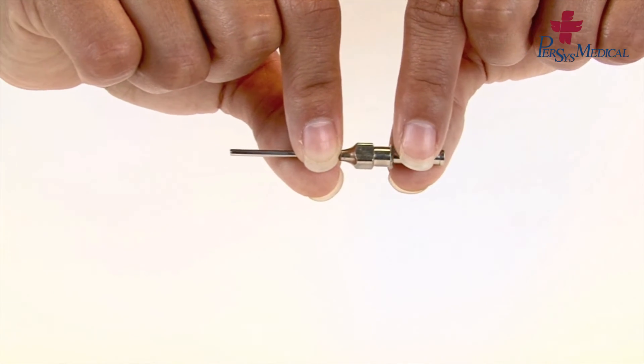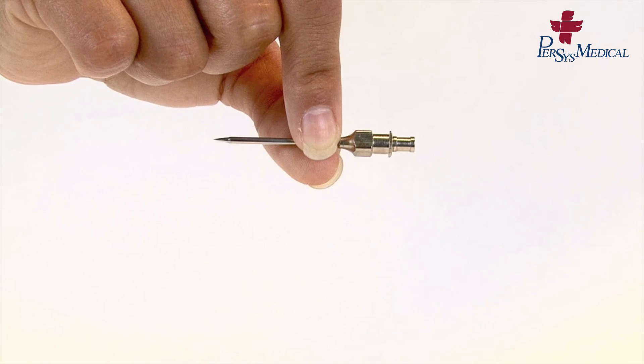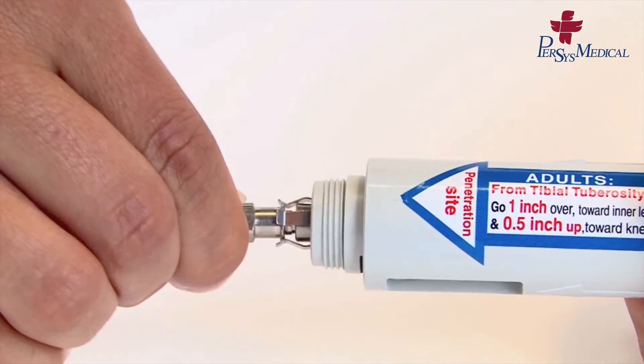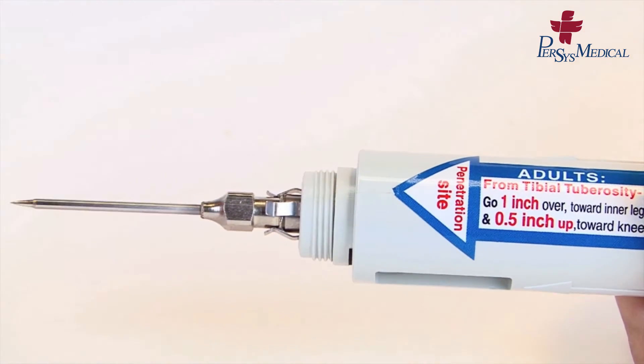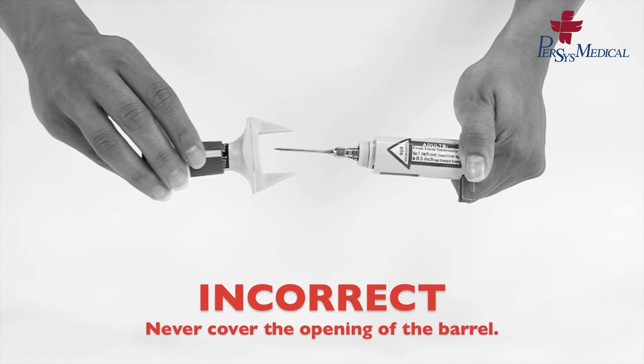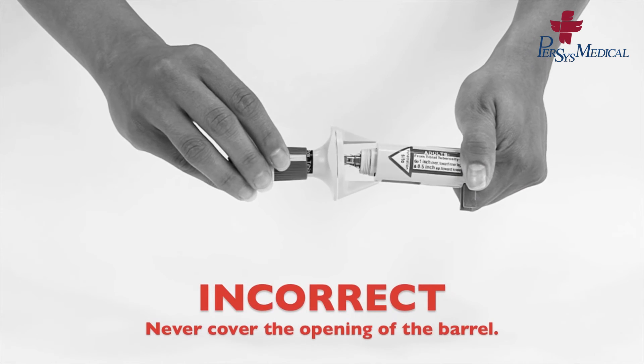Carefully place the needle into the cannula. Keeping the spring and piston pointed away from you, attach the needle and cannula to the clasp and ensure that it is secured. Always keep the spring and piston pointed away from you.